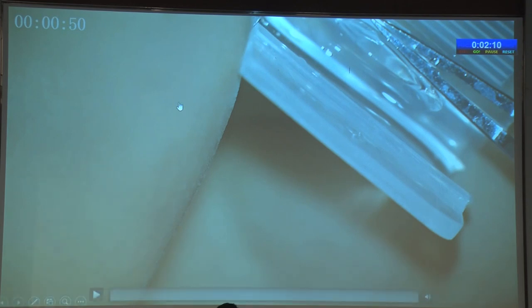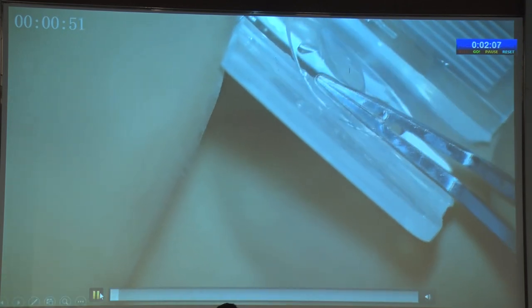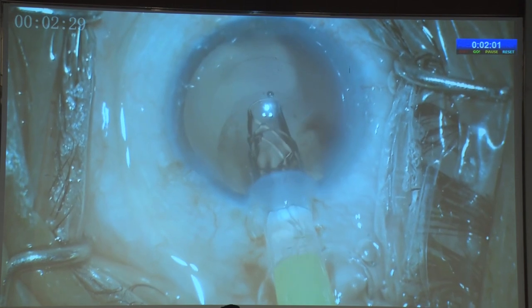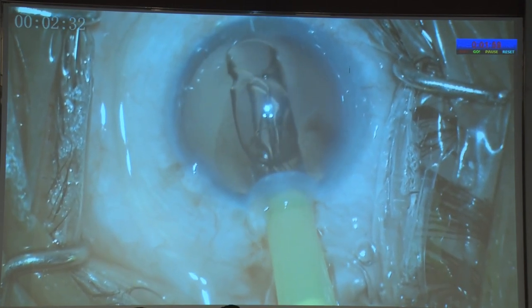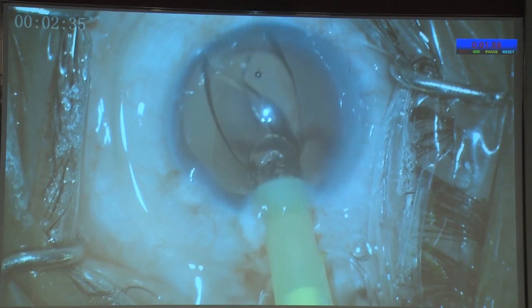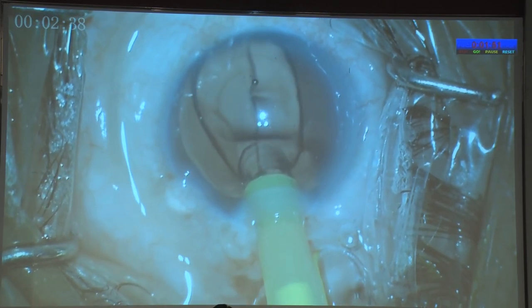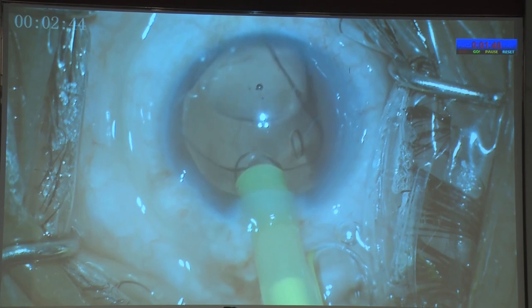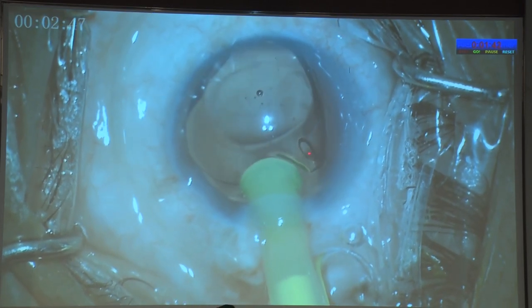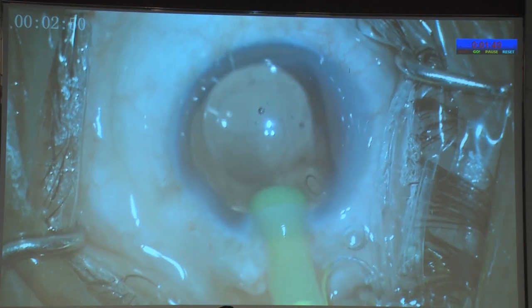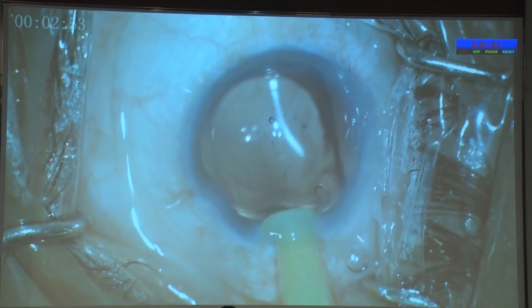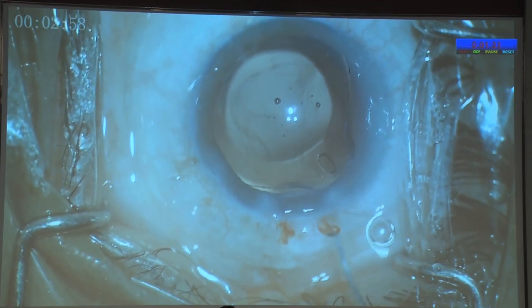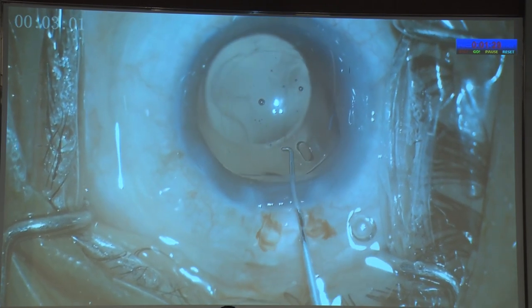This is a video of implantation where you can see it is just a regular procedure using a regular cartridge. Just like any other intraocular lens it is loaded and implanted. Made up of 25% water content hydrophilic material, it opens up slowly. All it takes is a simple nudge and it goes into the capsular bag. It comes with two dialing holes through which you can aspirate the viscoelastic behind the intraocular lens. With just a simple nudge it re-centers into the capsular bag automatically.